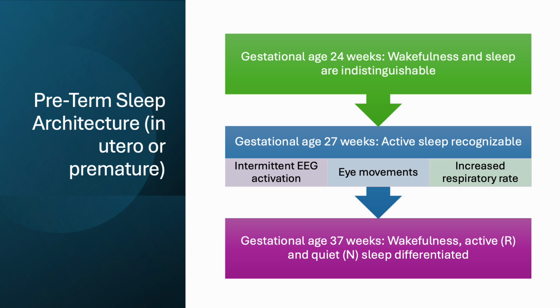My youngest pediatric patient was 16 weeks old post term, and I was able to check my impedance with my impedance meter so that I could just check the electrode that I just put on, and they were all fine before I plugged them into the head box. Children that young haven't been exposed to the elements, and their skin is sensitive and not tough at all.